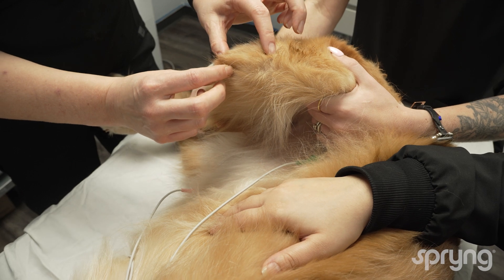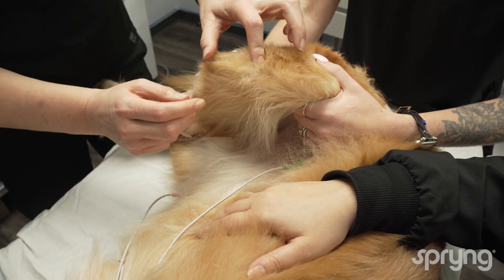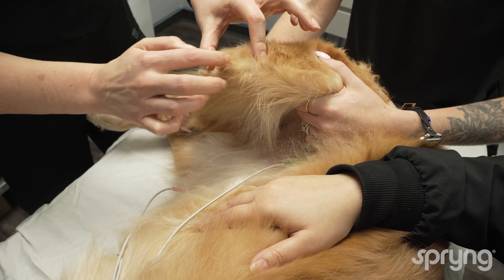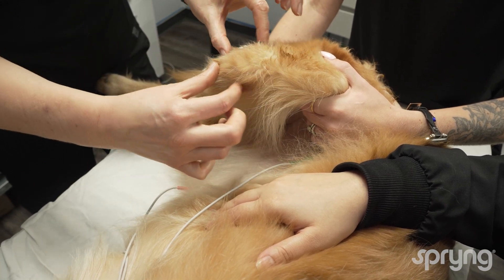Identify the landmarks: the tibial tuberosity, the patella, and the patellar tendon. Clip and clean the region.